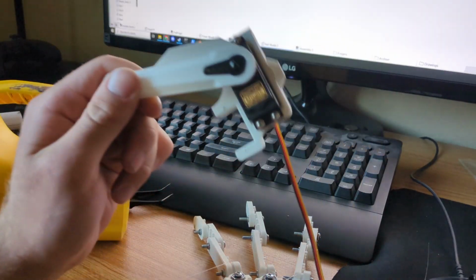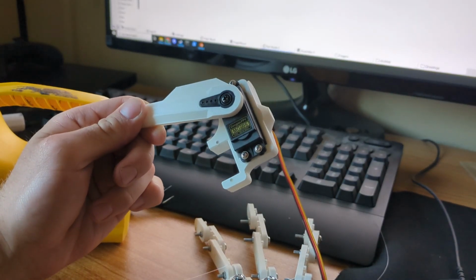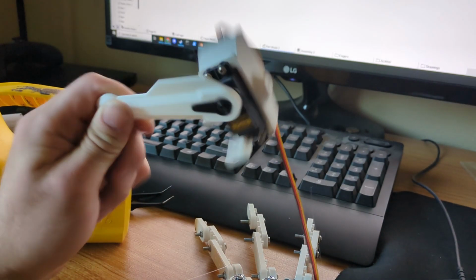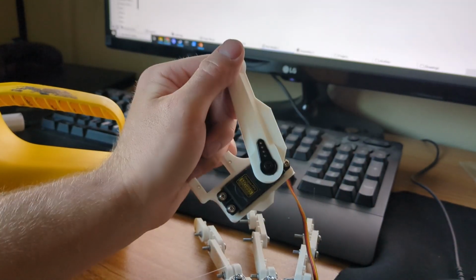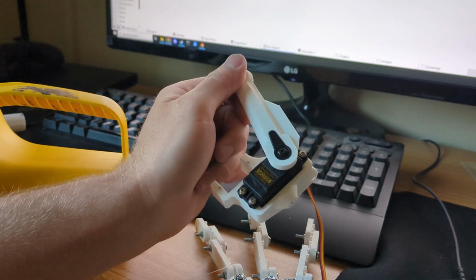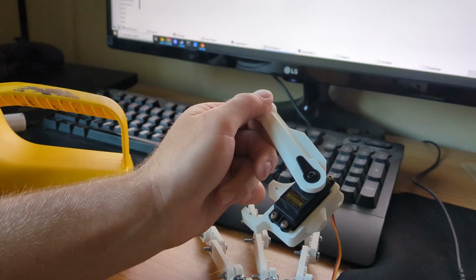These are from an older project, but I have these large servos and they're pretty strong. So I'll probably be driving it with these initially. And I might switch to a more modern approach. So instead of using a servo, use a brushless motor. That's what more advanced robotics projects are using because they allow for back drivability.